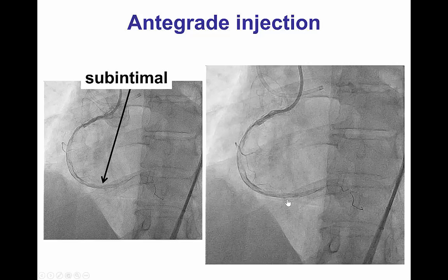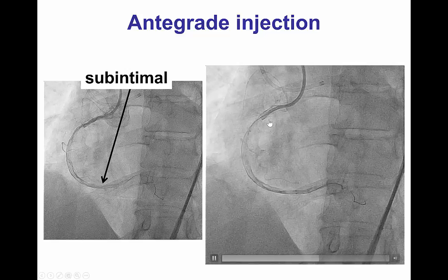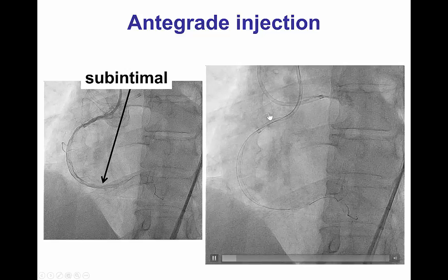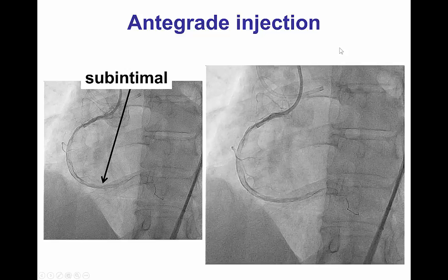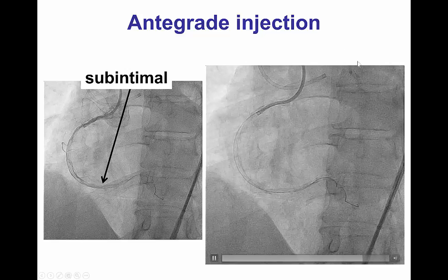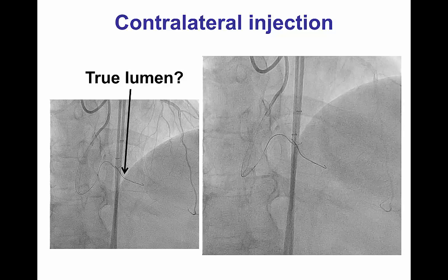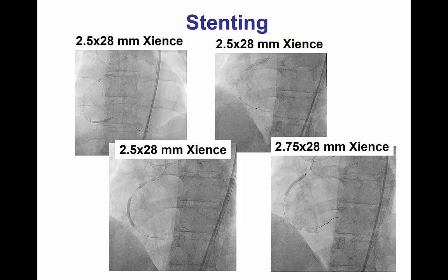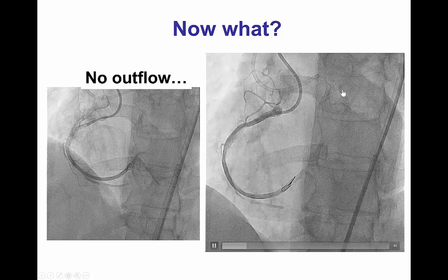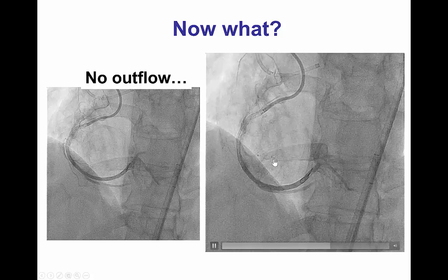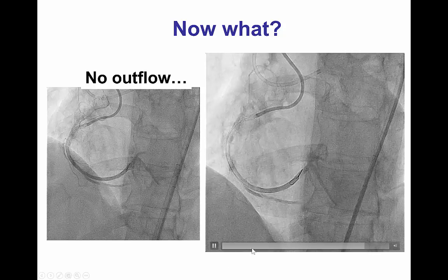We then attempted to re-enter into the distal true vessel. However, inadvertently during crossing attempts, there was an injection from the antegrade guide catheter. This is why it is important, when antegrade dissection-oriented strategies are used, to disconnect the antegrade manifold to avoid inadvertent injection. After wire manipulation, we believed the wire was in the distal true lumen and proceeded with stent implantation — however, we were clearly not in the true lumen. After stenting, the patient developed chest discomfort and ST-segment elevation, and angiography showed that outflow of every major branch — posterolateral, PDA, and PLV — was essentially cut off.